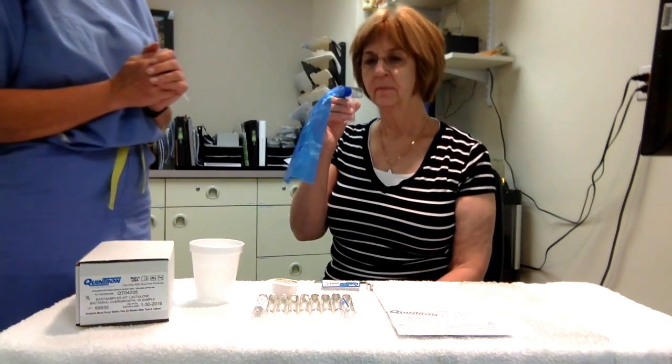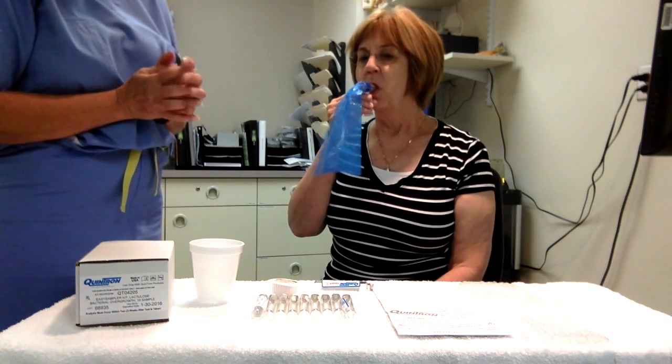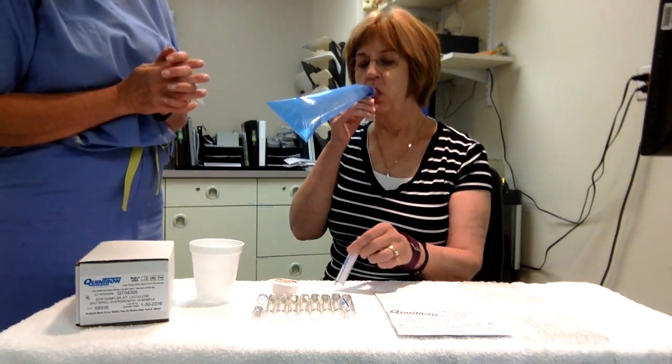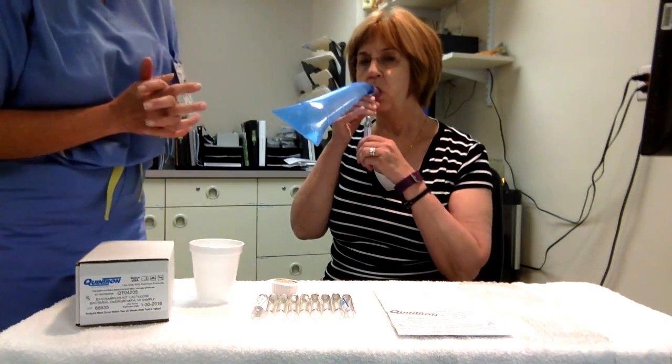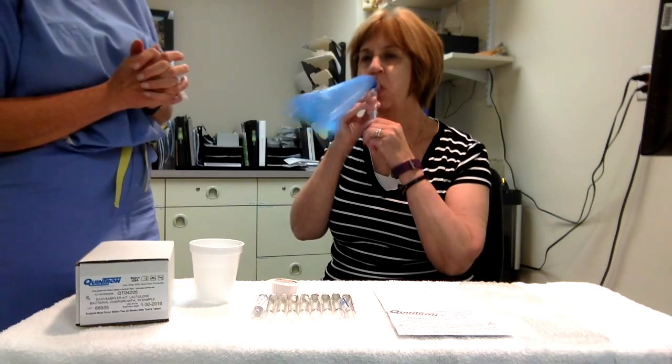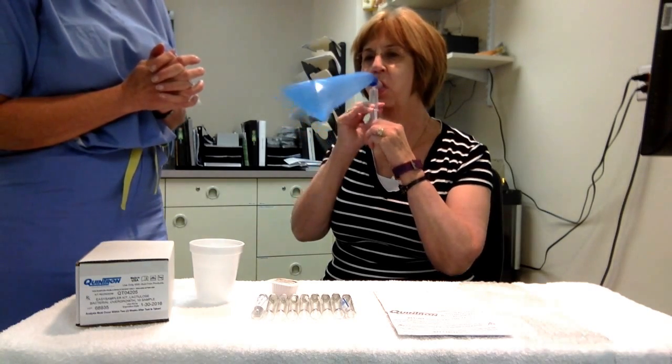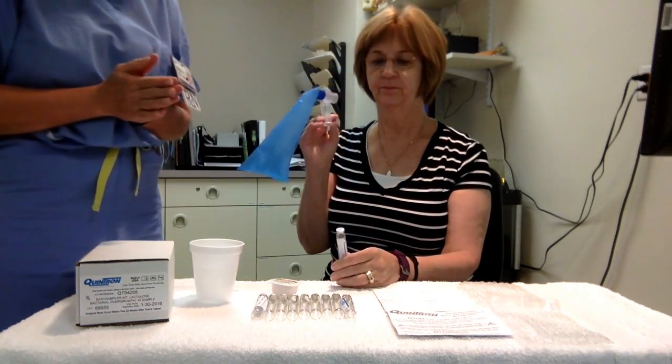Continue blowing, count one to two seconds, and then take the tube out and take the device out of your mouth. Take a breath in, put that right in your mouth and slowly breathe out to the bag. Now take the tube and puncture it into the bottom right there, continue breathing out. One, one thousand, two, one thousand — take the tube out and you've completed your first sample.